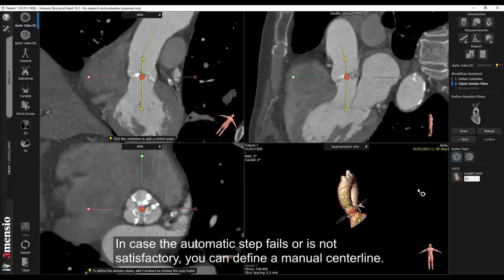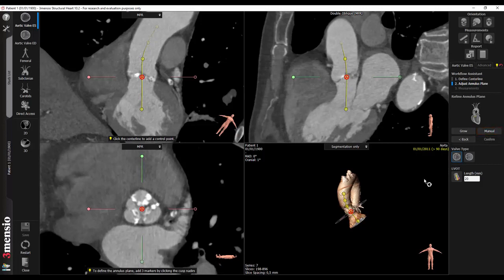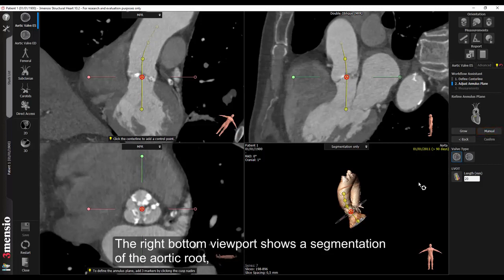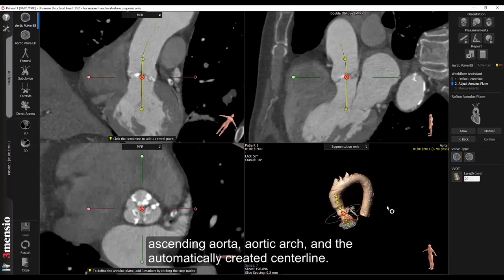In case the automatic step fails or is not satisfactory, you can define a manual centerline. This is explained in a separate tutorial. The right bottom viewport shows a segmentation of the aortic root, ascending aorta, aortic arch, and the automatically created centerline.